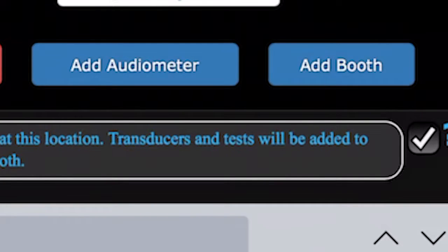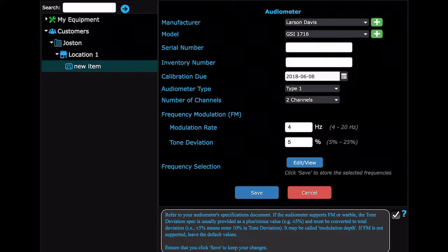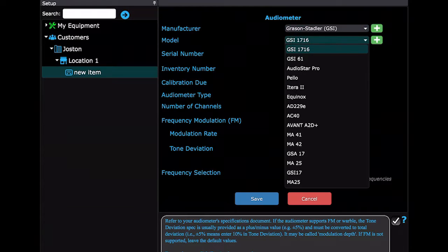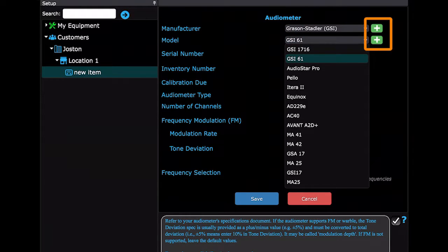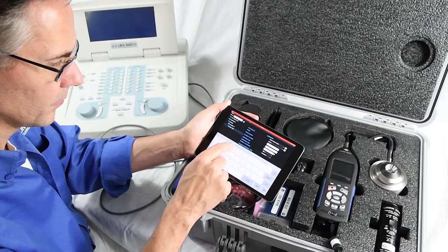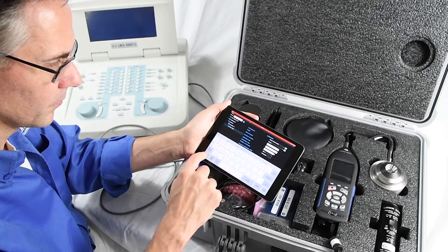Now you can add an audiometer or booth. We're going to add an audiometer. There are dropdowns for the manufacturer and model. If an item is missing from the list, choose the green Add button to the side to add to the list. This information will appear on the report, so ensure all fields are filled out.